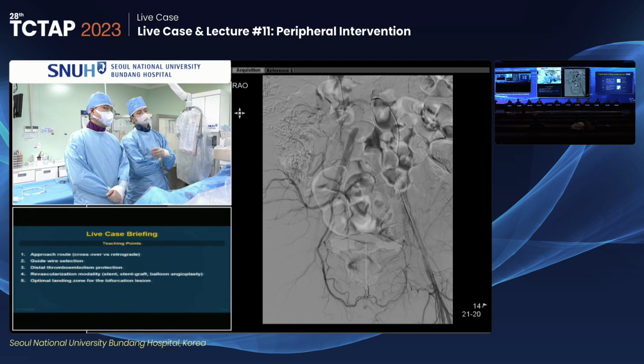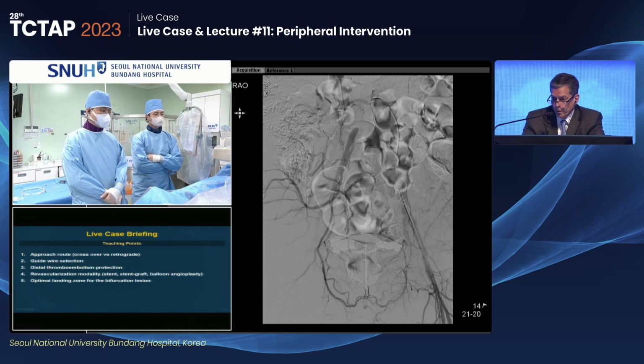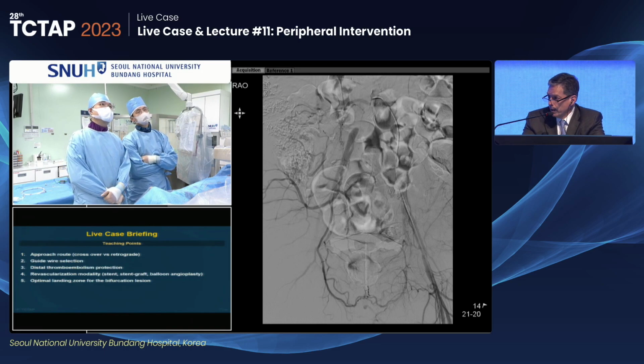He visited the neurologist frequently, maybe 6 months ago, so this is not an acute case. Given that, John, do you have any particular thoughts on your general approach here? Would it be retrograde? There's a beak on that side, and there's the crossover technique.